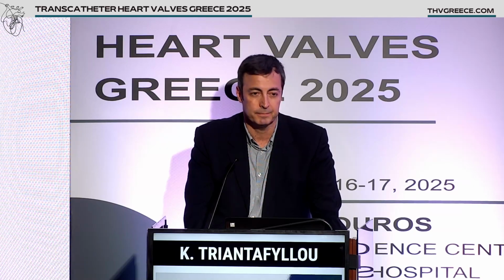Also a short comment from Dr. Zacharopoulos. Kostas, as always, great job. There are two spots I would like to touch up. You already said that, but I would like to stress that. One, that the chimney technique is very safe, and it's a very easy approach to tackling problems like how to protect your coronaries in such cases.